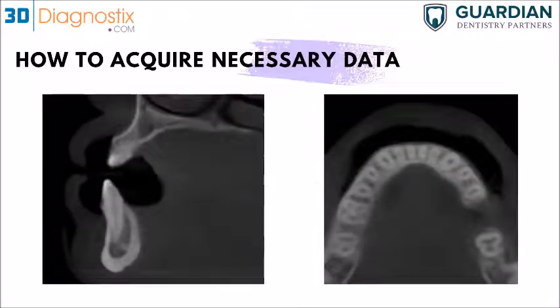And here's an example of, or screenshots of, a patient here being scanned with cotton rolls. And as you can see right here, we have the separation between the lips and the facial tissue, and the same thing on the opposing. And this is a look at it from the axial view. So you can see also here, this is the shadow of the tissue, which will also help with the merging of the patient's intraoral scan to the patient's dentition or the patient's cone beam.